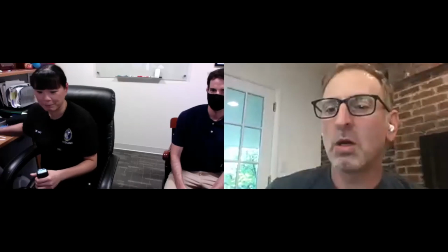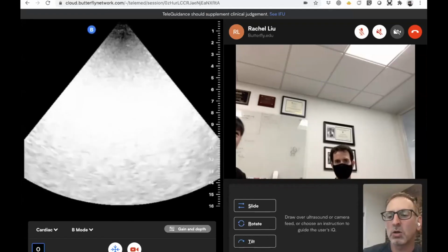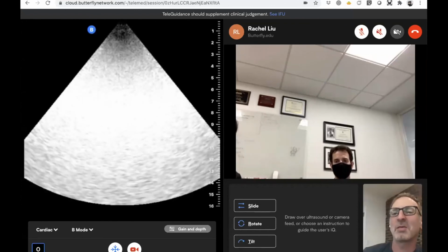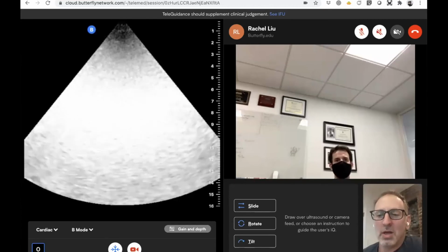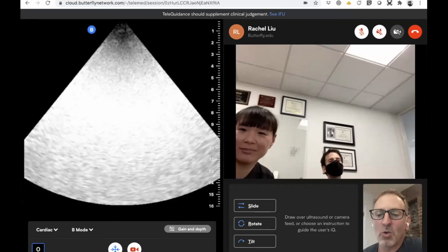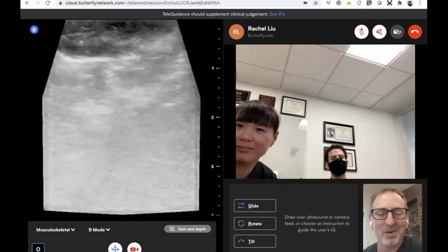So you had a radial nerve, you said? Yeah, radial artery was one, thyroid was one, aortic arch, erector spinae, cricothyroid membrane. I think we may have to set up a second scanning session. Why don't we do the neck, because there's a request for aortic arch, there's a few requests for thyroid, and there's a request for cricothyroid membrane, and all of those are in the same general real estate. So we can start off there.